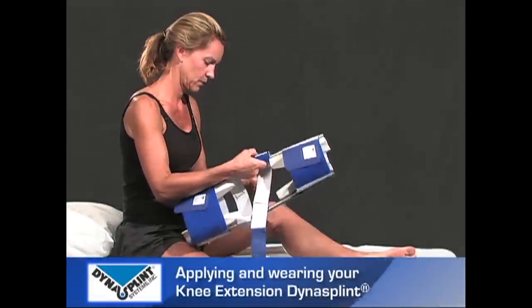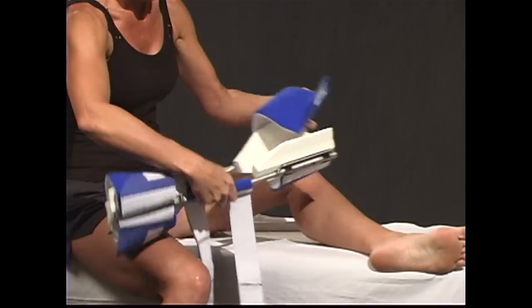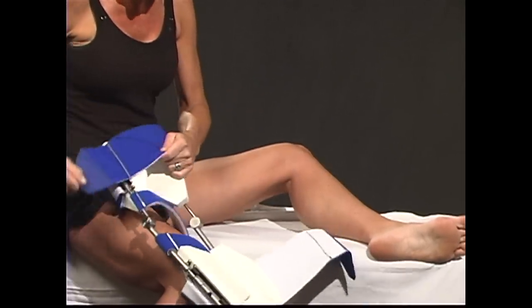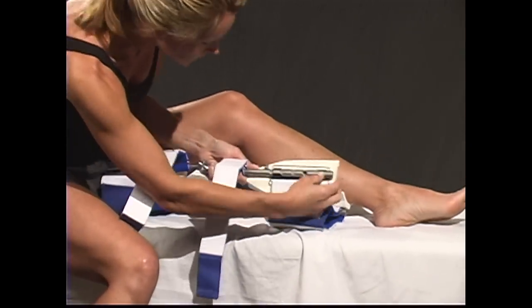While seated, with your leg in front of you, open the front of thigh, shin, and two counterforce straps. Place the DynaSplint under the affected leg.